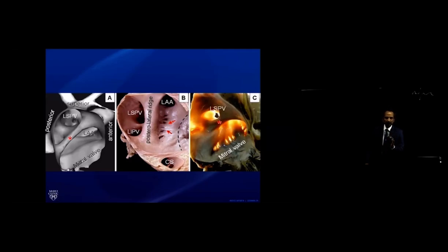It brings in a whole new vantage point for ablation, and a whole new source of difficulties. You can be perfect with cavotricuspid isthmus ablation, know every trick in the book to ablate it, but you have a few new things with left atrial ablation. One is the posterior boundary, isolation of the vein. The second is the issues with the coronary sinus.